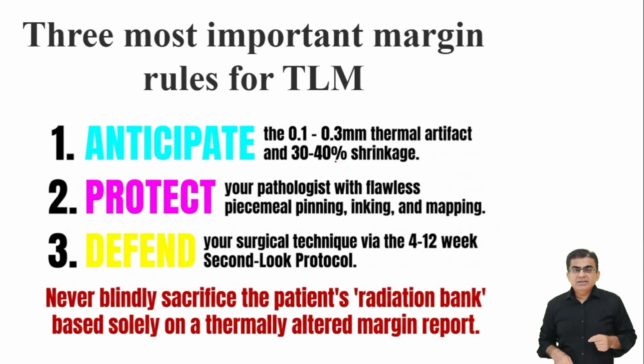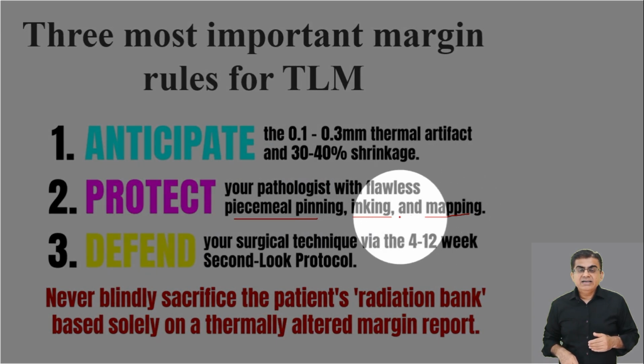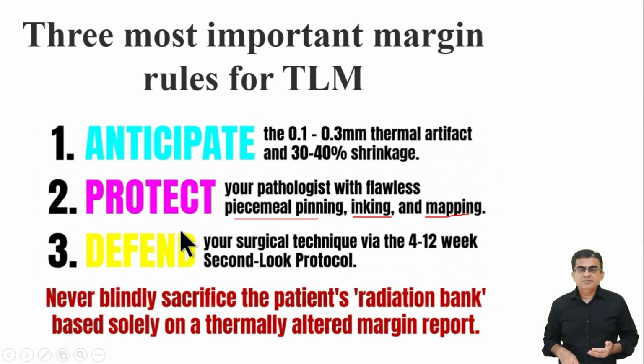Second, you must physically protect your pathologist. You must strictly do this by flawlessly pinning, color inking, and mapping your piecemeal fragments. Third, you must boldly defend your surgical technique. You must safely do this by using the second look protocol between 4 to 12 weeks.